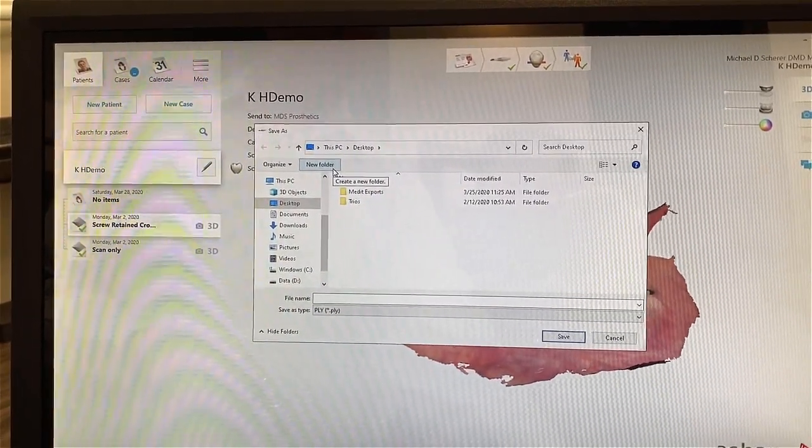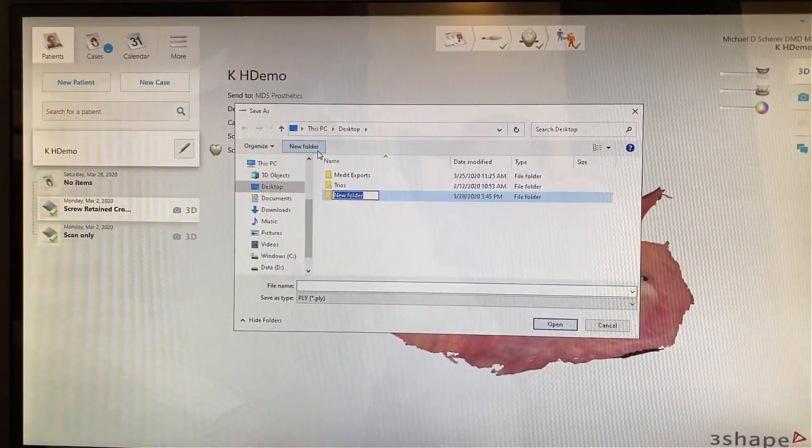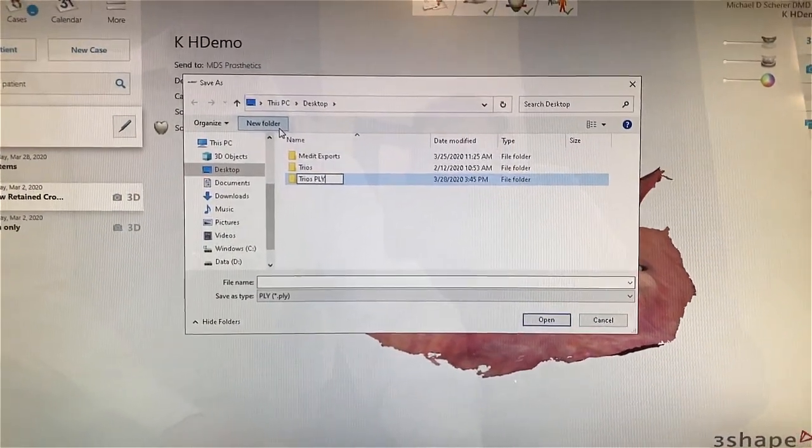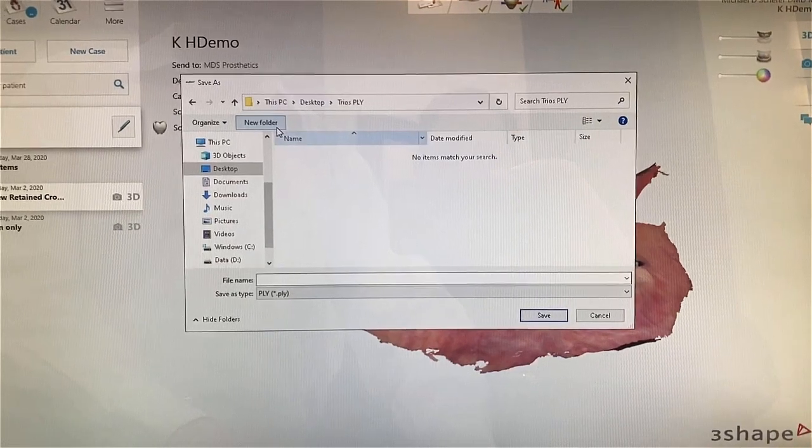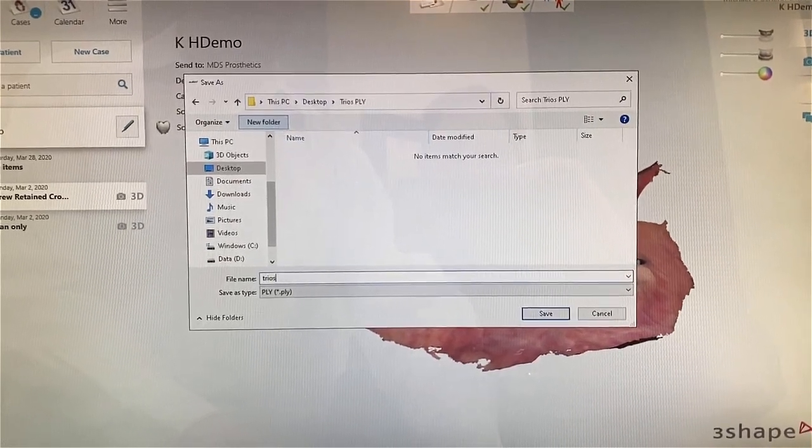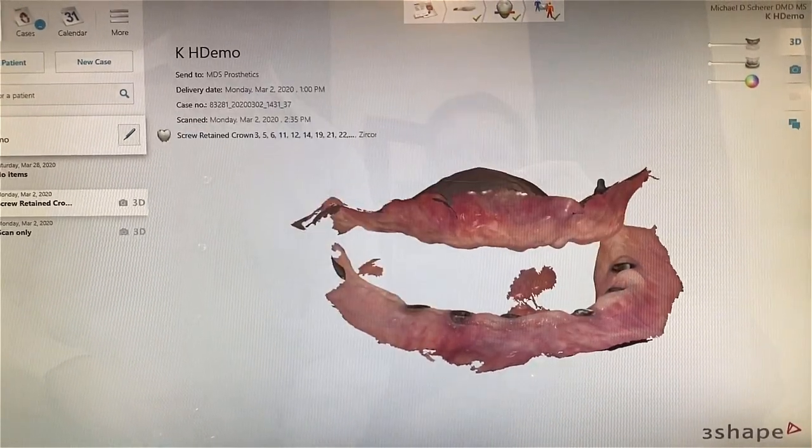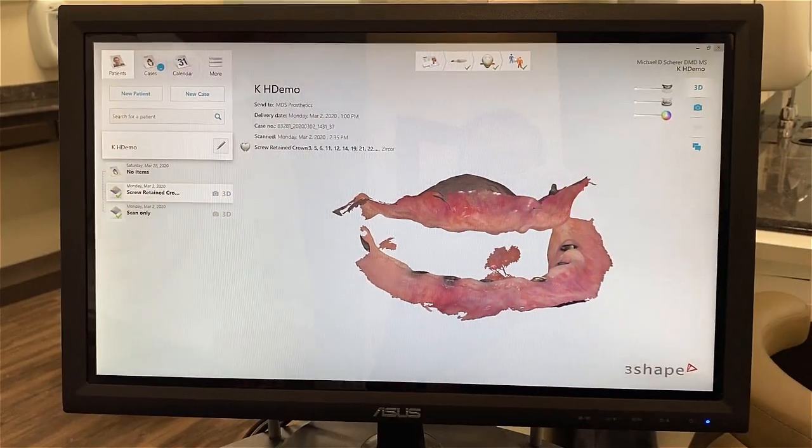So I'm going to go ahead and choose Color PLY, and then I'm going to export to TRIOS PLY, and I'll give it a name like TRIOS PLY, and it will export to my desktop.